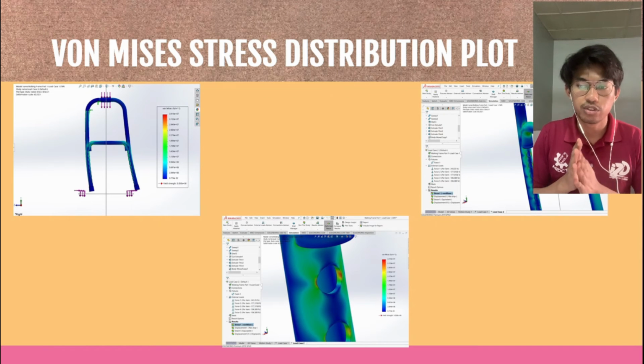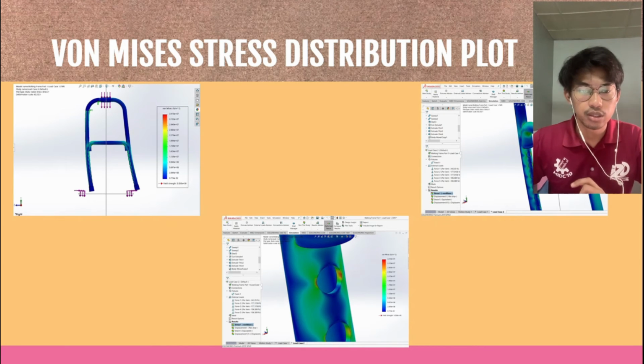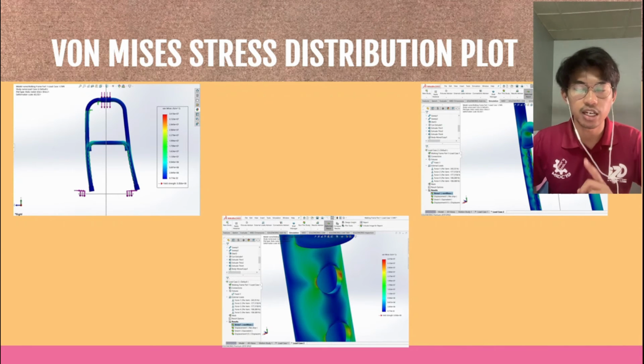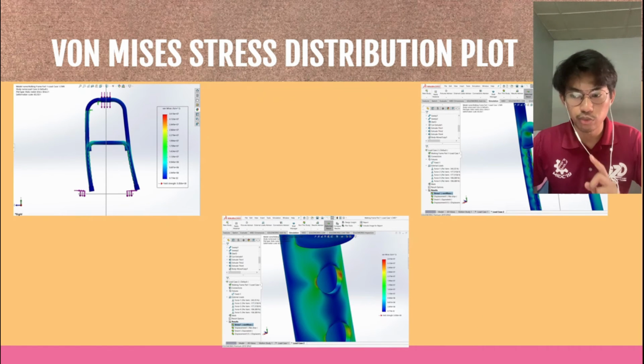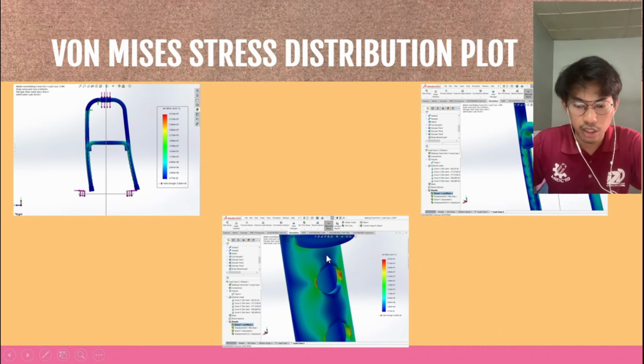This is the von Mises stress distribution plot for the draft quality mesh and the high quality mesh. Both of them have the same distribution plot. From the finite element method analysis, we found that the distribution plot is not uniform due to the irregular shape of the worker frame. And from the analysis, we also found that the most critical points for the worker frame are at the holes for each leg of the worker frame, as you can see here.